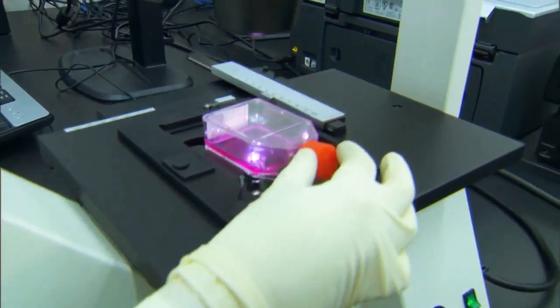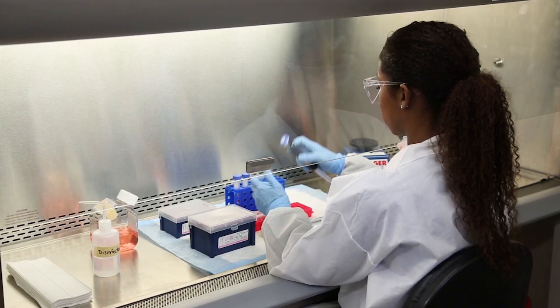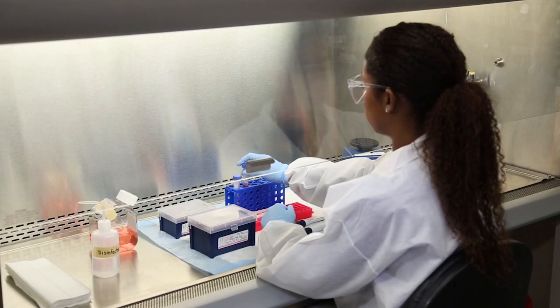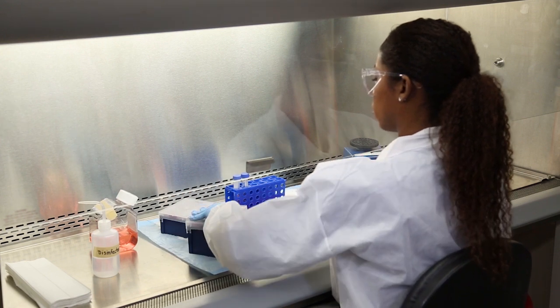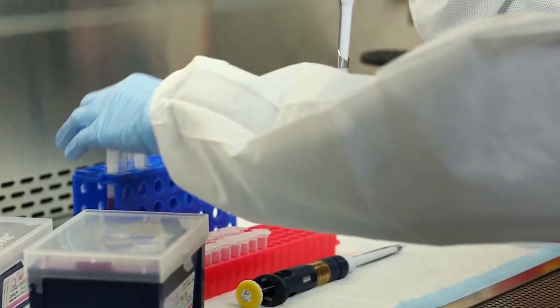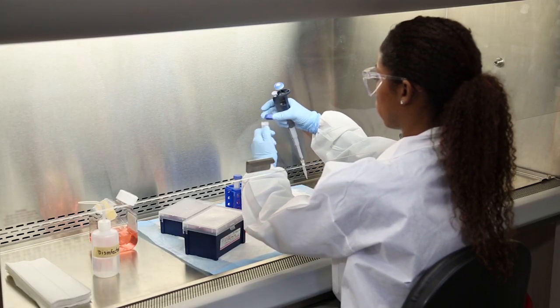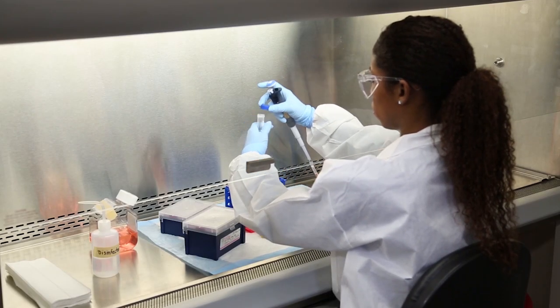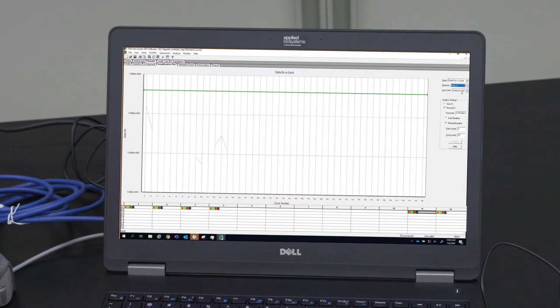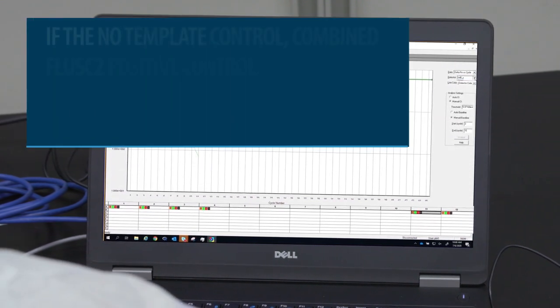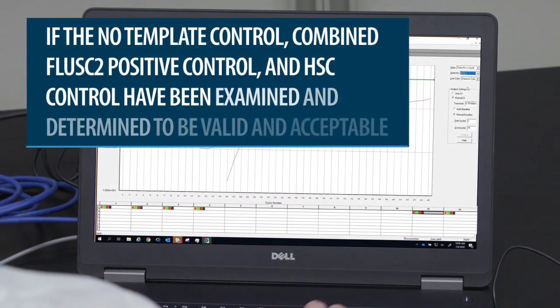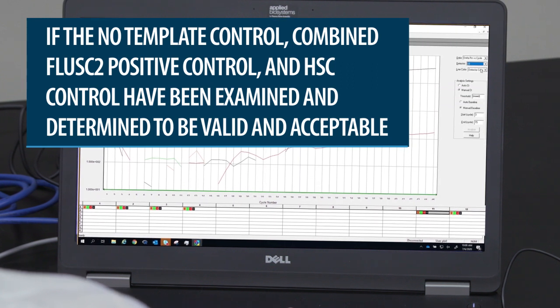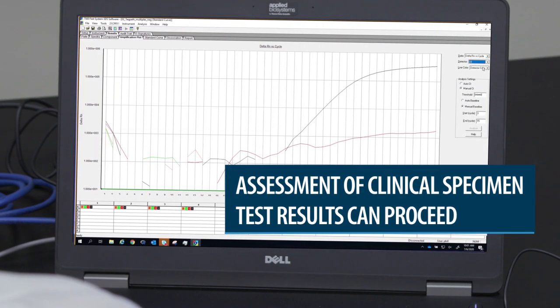If the HSC control fails to give the expected results, invalidate the run and repeat extraction and RT-PCR testing for all specimens extracted alongside the failed HSC control. The no-template-control, combined Flu SC-2 positive control, and HSC control should be evaluated before any patient data is interpreted or recorded. If the controls do not give the expected results, the run should be considered invalid and a retest is necessary.